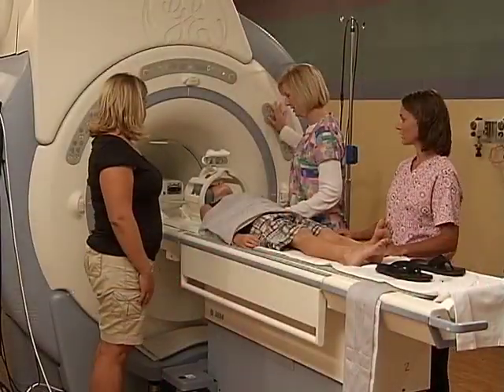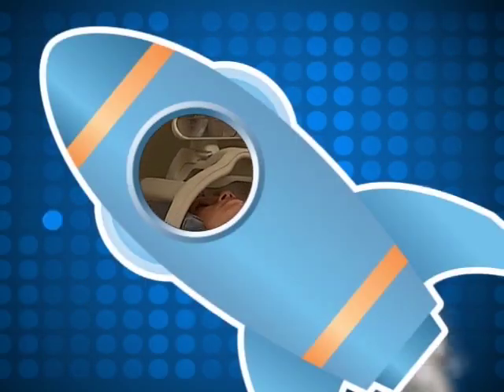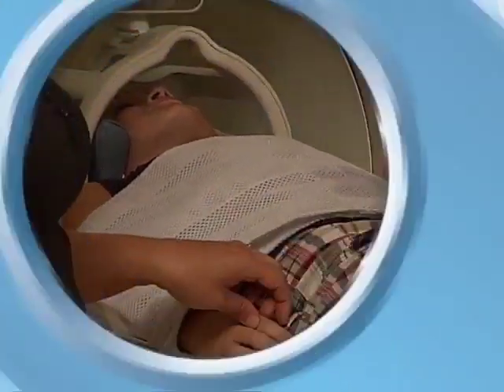Once you're wearing your helmet, the journey begins. Your bed will move again and take you inside the tunnel to take your pictures. Imagine you're gliding through space in a slow-moving rocket.